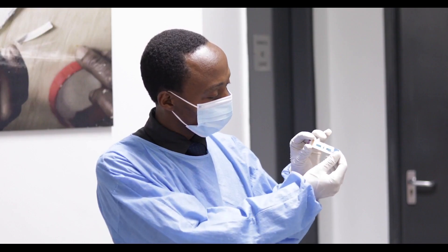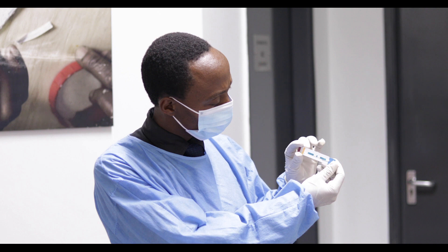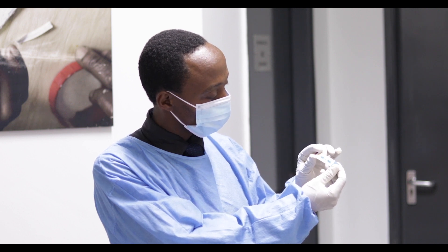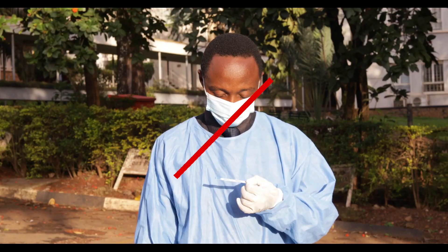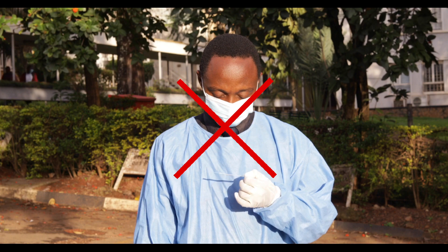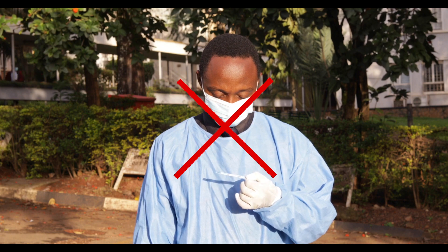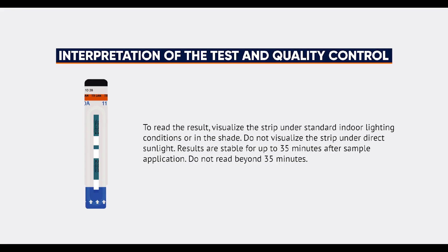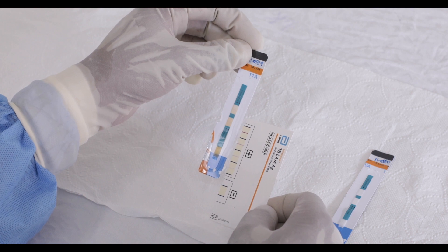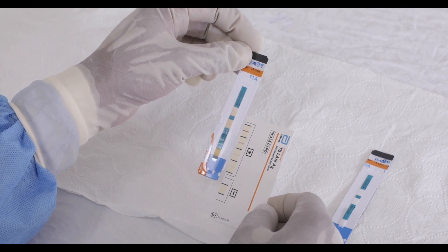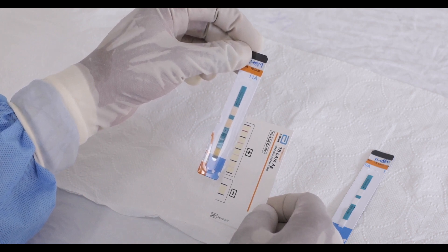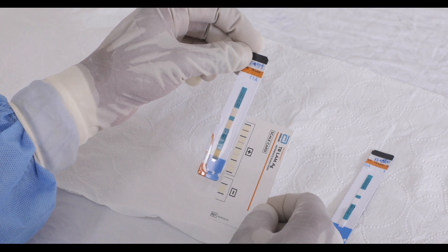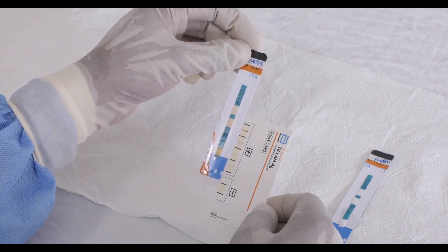To read the result, visualize the strip under standard indoor lighting conditions or in the shade. Do not visualize the strip under direct sunlight. Results are stable for up to 35 minutes after sample application — do not read beyond 35 minutes. Use the reference scale card provided in the kit to assist with results reading and interpretation by holding it alongside the patient window.